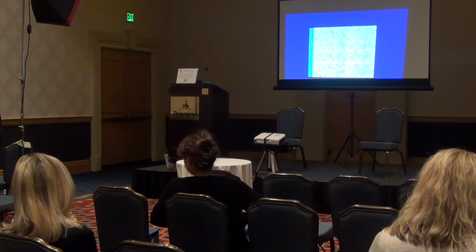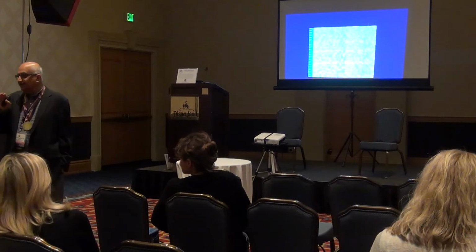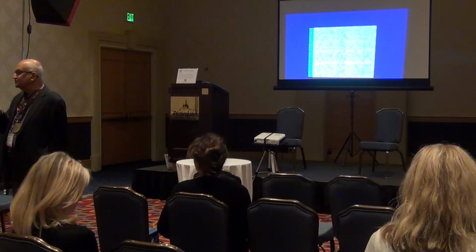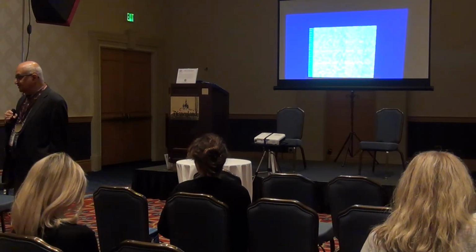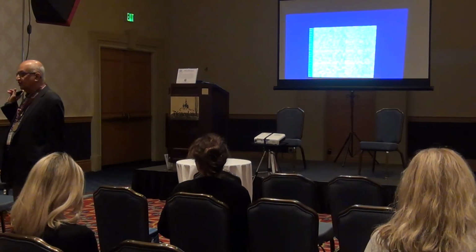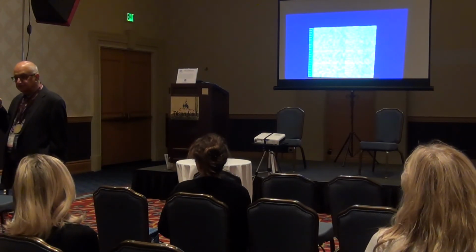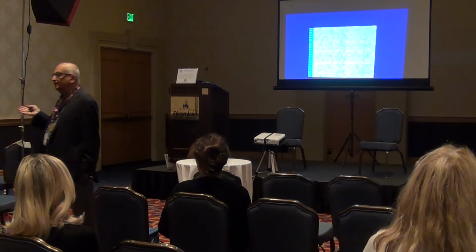Right? Because, seriously, a lot of times I get young babies that do funny things, which may be benign, but then there's a suspicion. So we admit them for rule-out spasms. So the family comes very sensitized to this abnormality. This is called hypsarrhythmia. Hyps in Greek is mountains, right? It's mountainous slow waves, chaotic sharp waves.